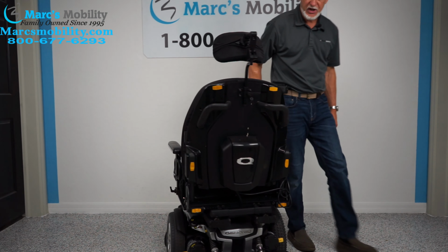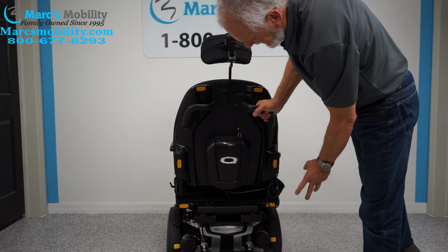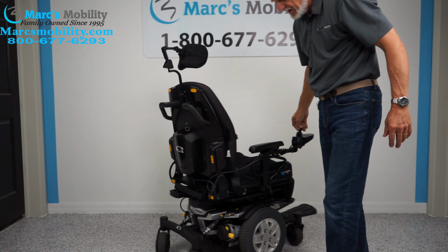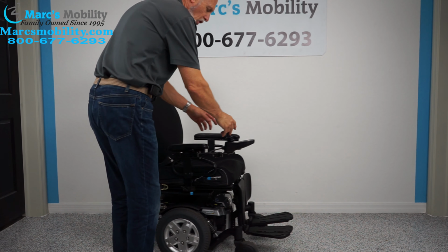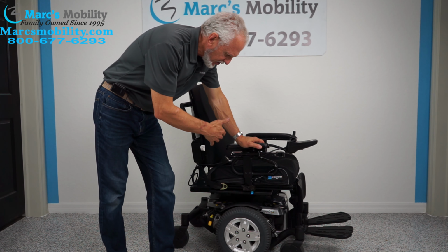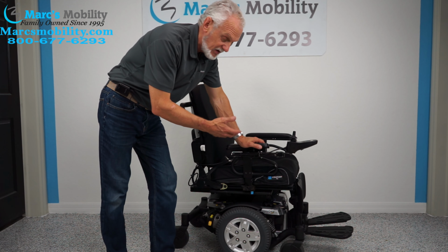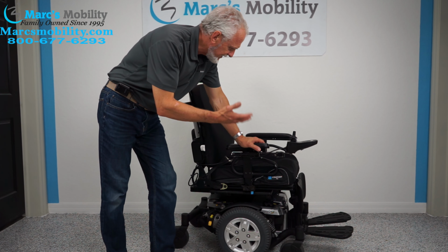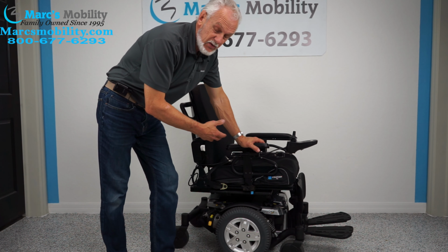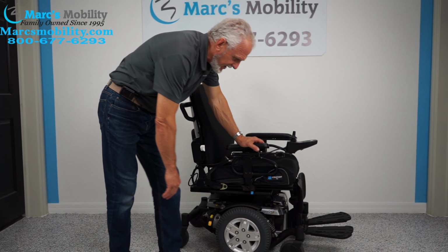The back of the power chair, you got push bars. You got push bars there, and you can see how solid that chair is. It's just a solid chair. So, well, it's a heavy-duty chair. This is an older model, so I don't really know. It looks like these are the original tires. So if these are the original tires, it was dusty because it's been sitting for a while, so we did dust it off. But everything's original. I would say this chair was probably used for 6 months at the most because there's no wear really to talk about on the tires.